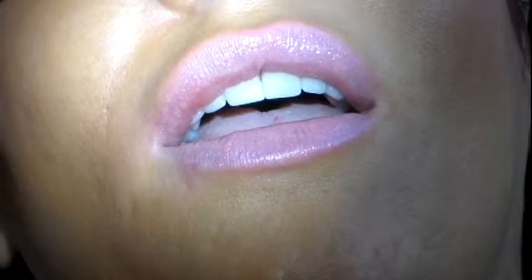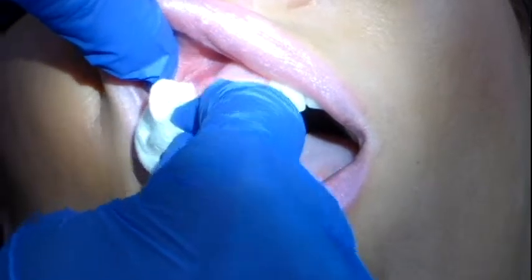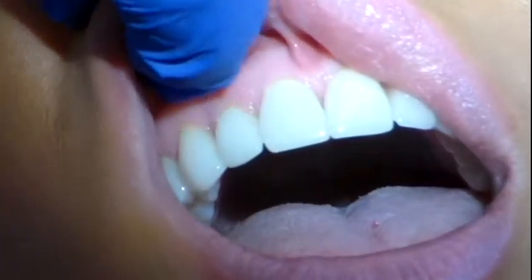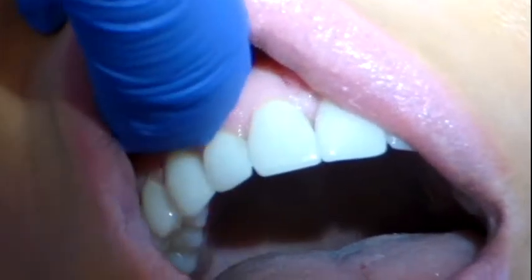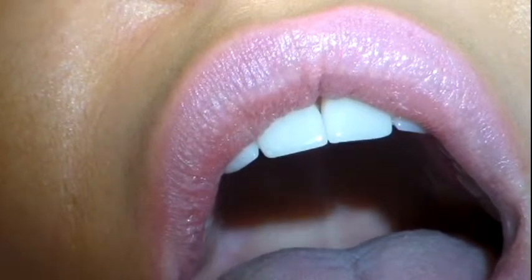So we're going to remove the topical, and then we're going to wipe the excess off. When you're working up here on these anterior teeth, you have to be really careful, because some people have a really tight frenum, and if you're pulling really hard, it can really hurt. So if that's the case, get your finger way up in there and pull more from the inside of the cheek. Okay, so I'm going to proceed with the injection.